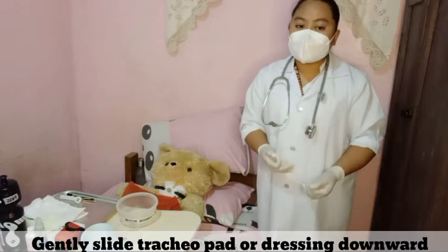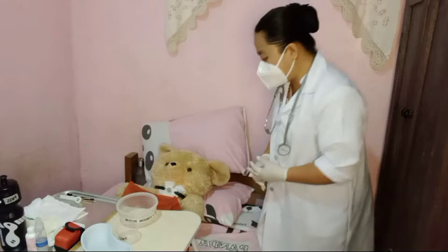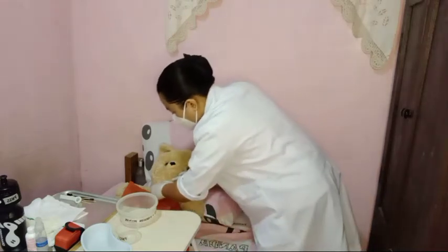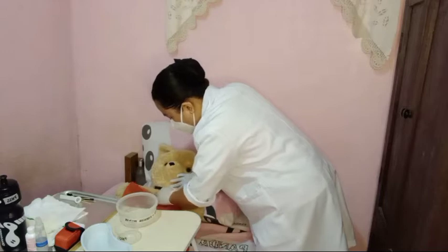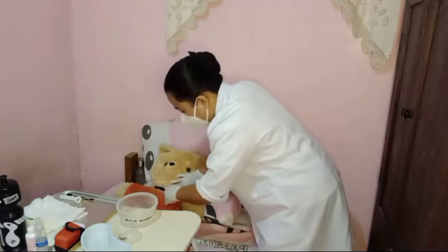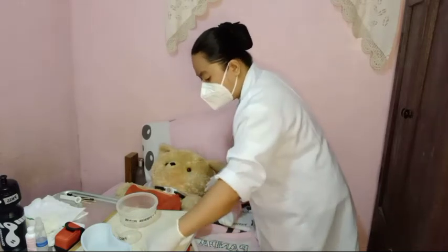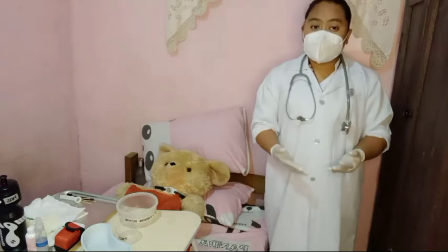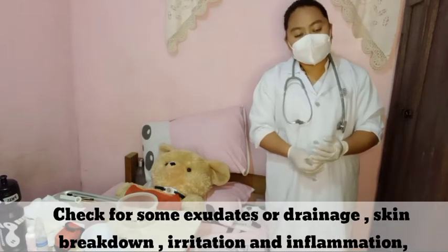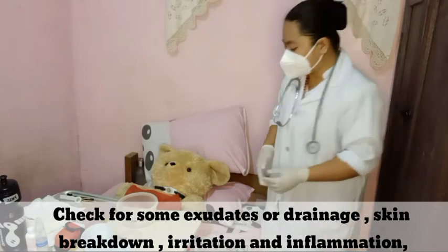Simultaneously, gently slide the tracheopad or dressing downward and discard. And then check for exudate or drainage, skin breakdown, skin irritation, and inflammation.